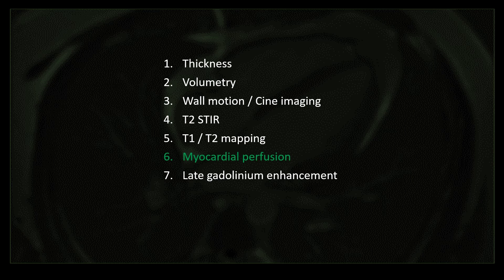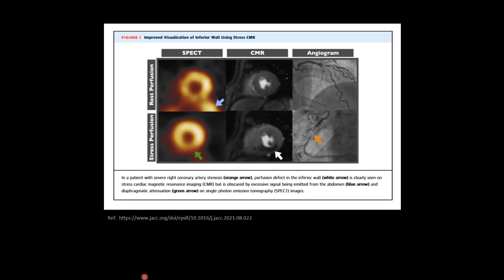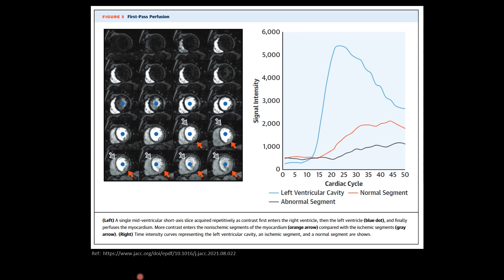Now coming to myocardial perfusion. Perfusion images are obtained as FLASH MOCO or motion-corrected images. First the contrast enters the right ventricle, then the left ventricle, then the entire myocardium enhances. You should look out for any non-enhancing areas, which could be a scar or an infarct. On a corresponding LGE image, enhancement in the same area is suggestive of infarct or scar. We can also see correlation of perfusion with SPECT and angiogram — non-enhancing areas on perfusion correspond to reduced uptake on SPECT and stenosis on angiogram in that vascular territory.